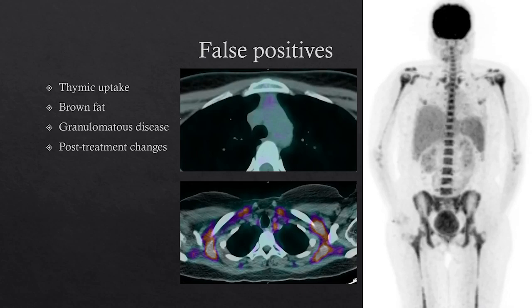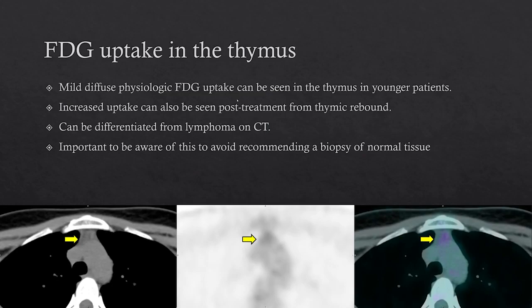Here's an example of FDG uptake in the thymus. You can see the thymus on CT, and on fused images there's uptake greater than the adjacent blood pool activity. This can be seen normally in younger patients, up to the mid-20s, and also in thymic rebound, which can occur even in older patients. It's important to differentiate this from any tumor suspected in this region — usually a concern in lymphoma — to avoid recommending biopsy of normal thymic tissue.